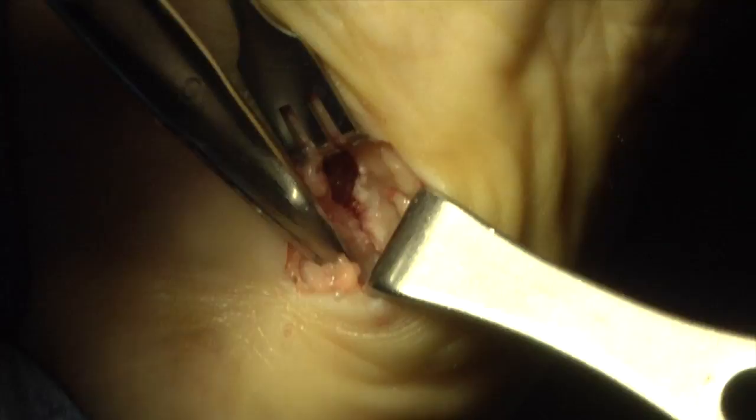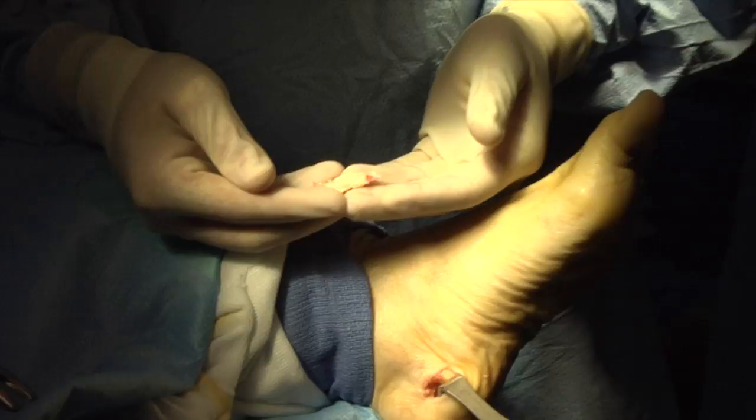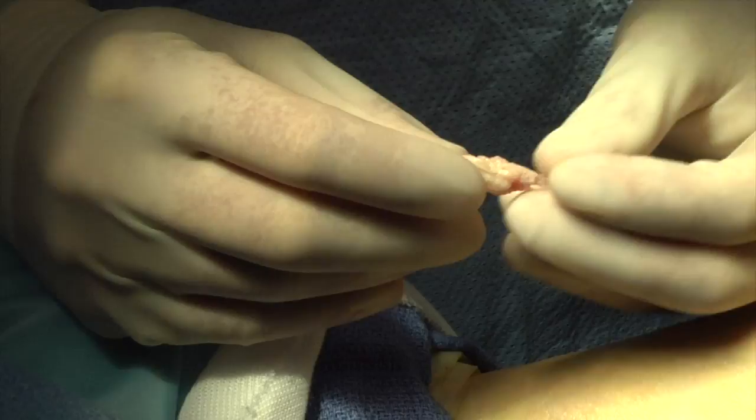As for the heel spur itself, I'm going to release part of this tag of the plantar fascia right here at the heel, and then use a reciprocating rasp to take the spur down. Here's a small piece of the plantar fascia that I've removed that was connected to the bone to reveal the bone spur so I can file it down, and enough of it removed so it won't reattach.